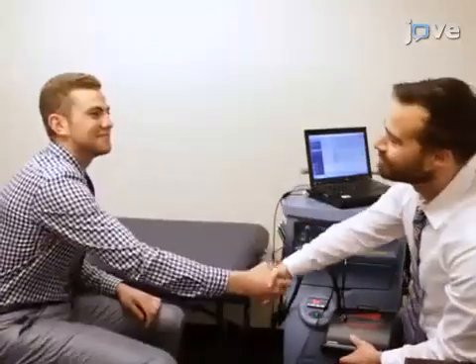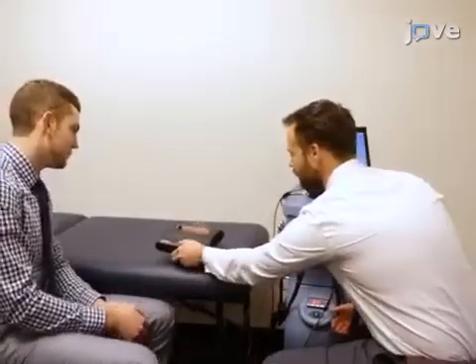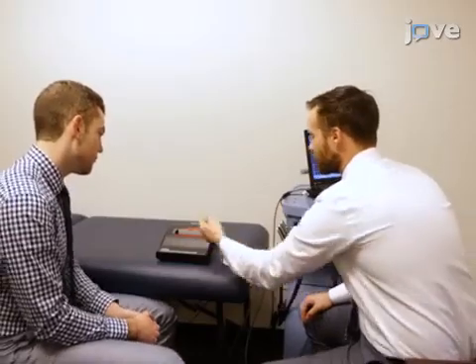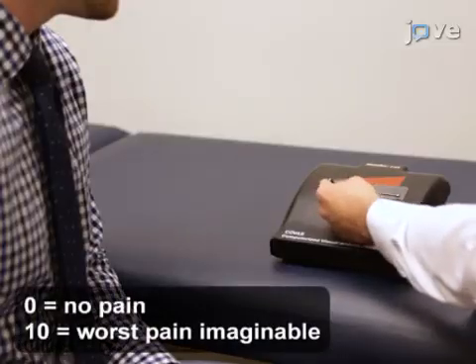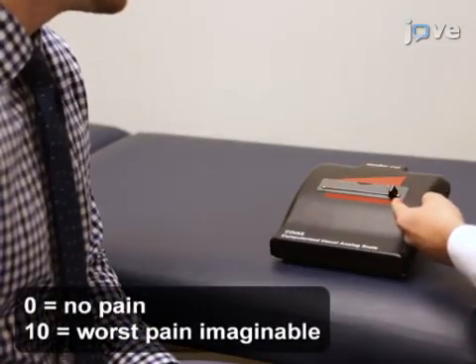Present the computerized visual analog scale, COVAS, to the subject. Define the anchor points such that 0 means no pain and 10 means the worst pain imaginable.